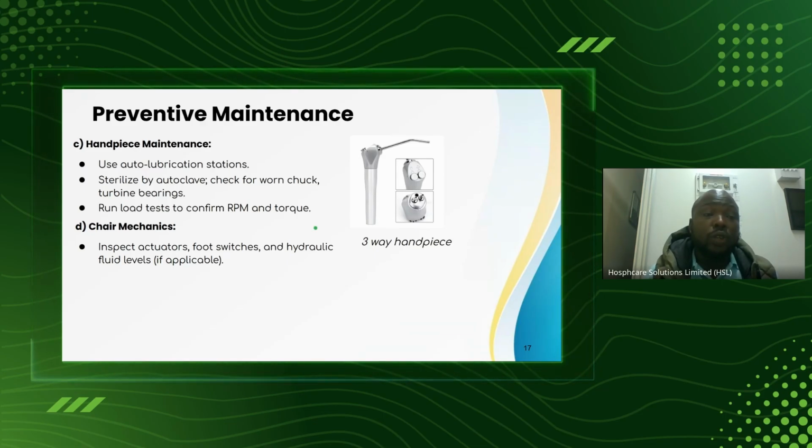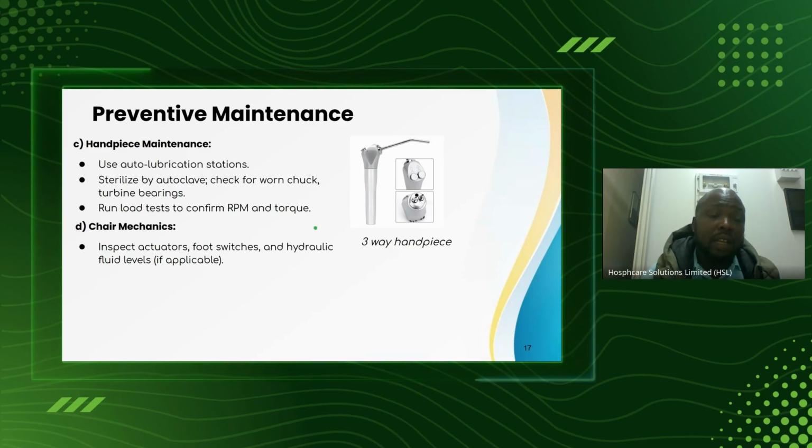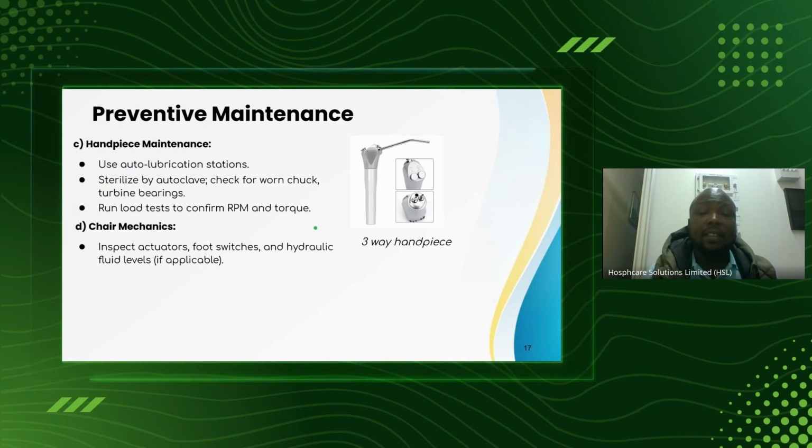So what do you need to do? You need to make sure that the turbine is clean. There is a procedure on how you clean the handpiece. I will go into details once we get another chance, or if you have any question, I will explain that. But the handpiece needs to be cleaned and sterilized after every single operation to remove the clogging particles and prevent cross-infection from one patient to the other.